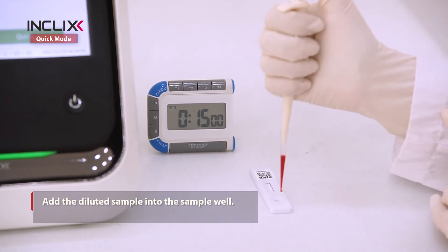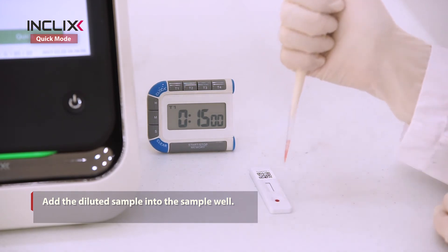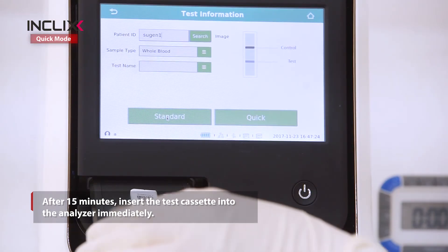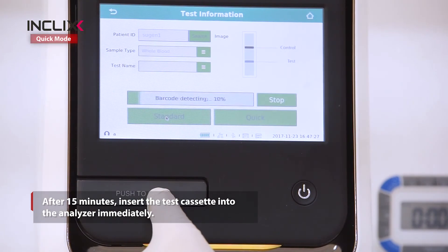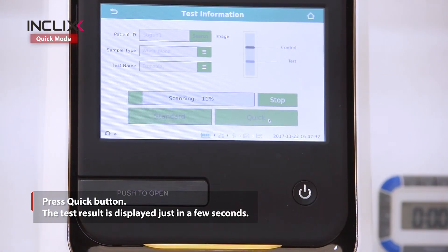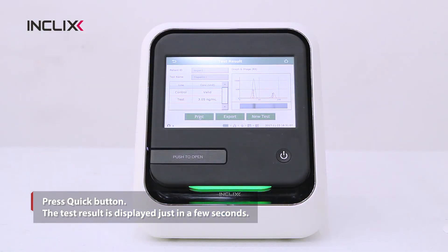Place the test cassette on a flat surface and add the diluted sample into the sample well. After 15 minutes, insert the test cassette into the analyzer immediately and press the Quick button. The test result is displayed in just a few seconds.